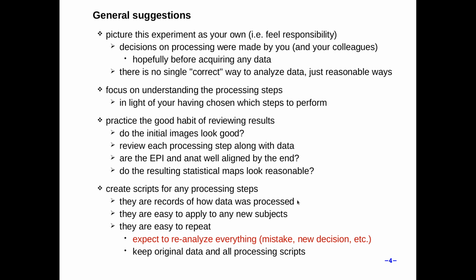If you're asked 6 or 12 months after an analysis, so exactly how did you do this step? It's not good enough to say, well, I don't know. I opened the data sets in AFNI and I pressed the buttons. I forget exactly what I did to get that last step right there.